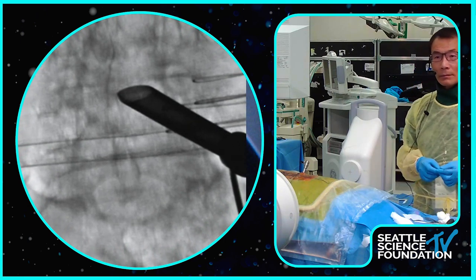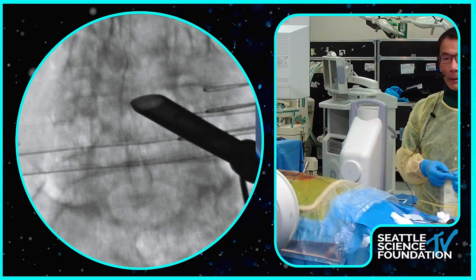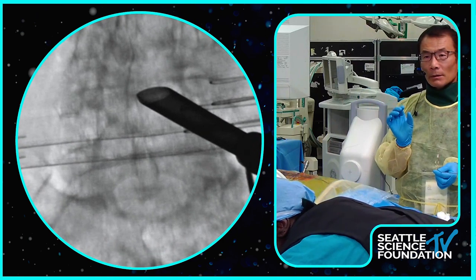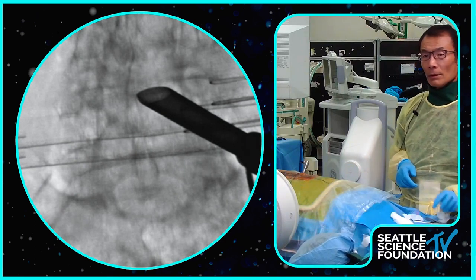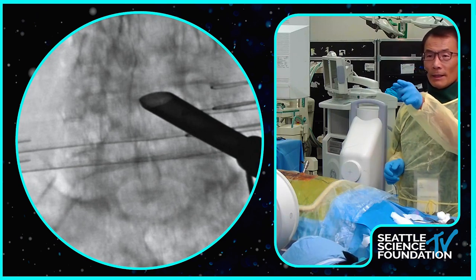Right now I've got air in the system and I've got bubbles. Yeah, you can see the S1 pedicle there. Move it back a little bit so they can see. Like you see, it's barely flowing. I've got air bubbles everywhere. You can just hook it up to gravity. It would be 1,000 times better.